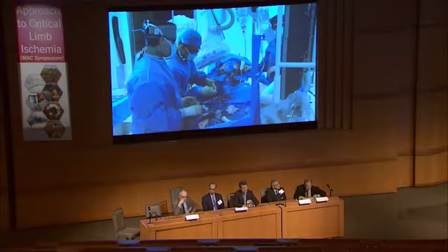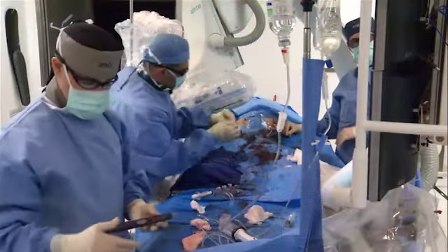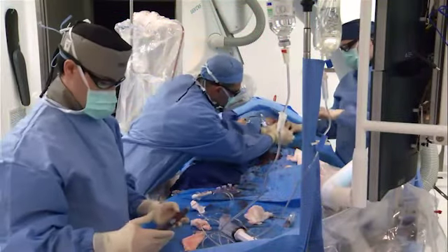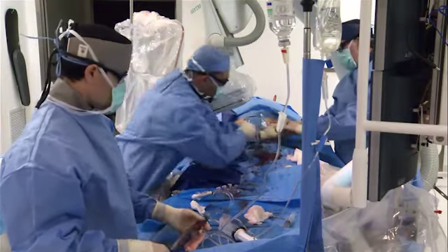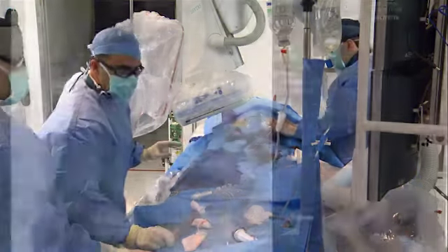So, Craig, we are going to go with the Supera 6 by 120 right now. Okay. I went as high as I could. I think that area is going to give me a hard time with the Supera. I know it already. So I'm going to declare it before we get to it, but let's see what happens. I think we're going to have a little bit of a challenge, but I did as much preparation as I could.